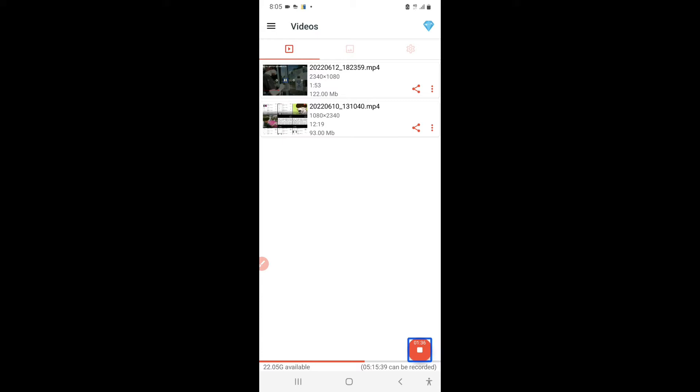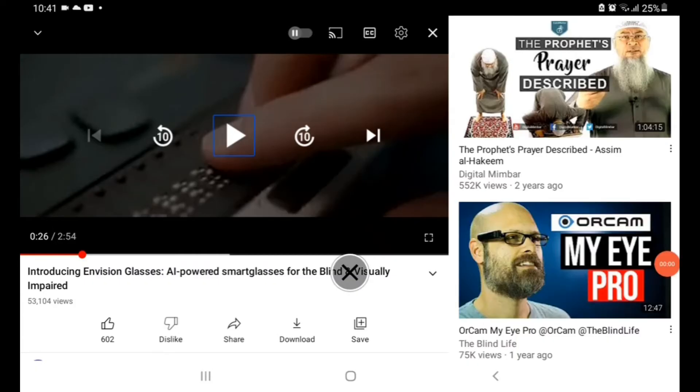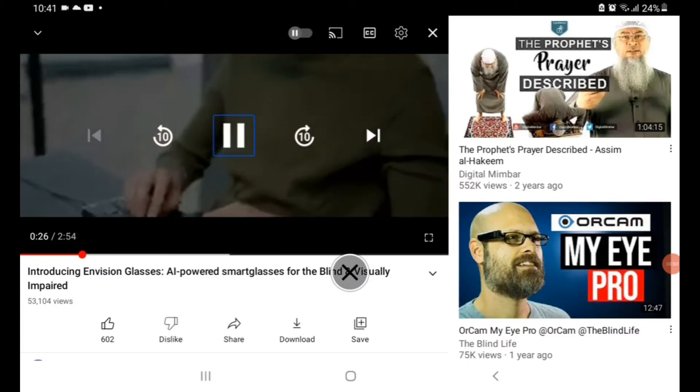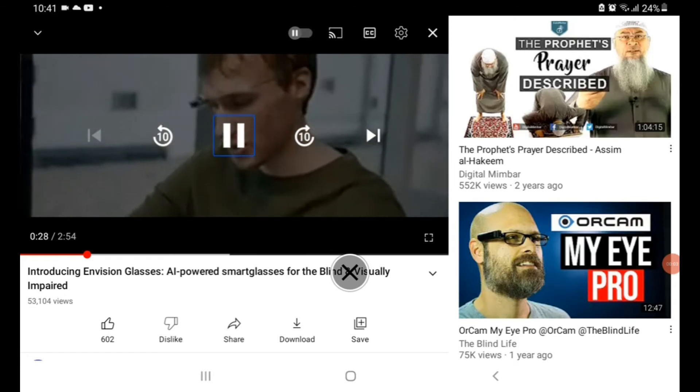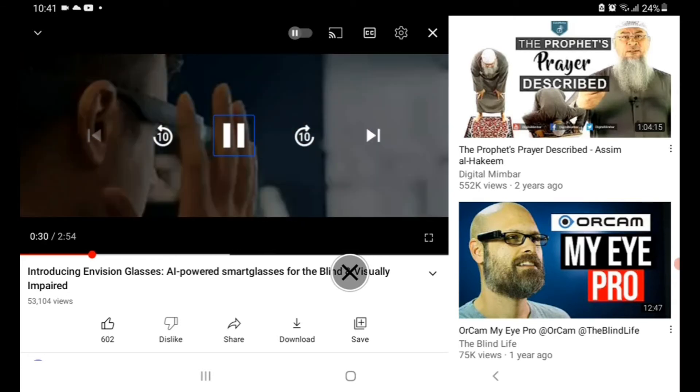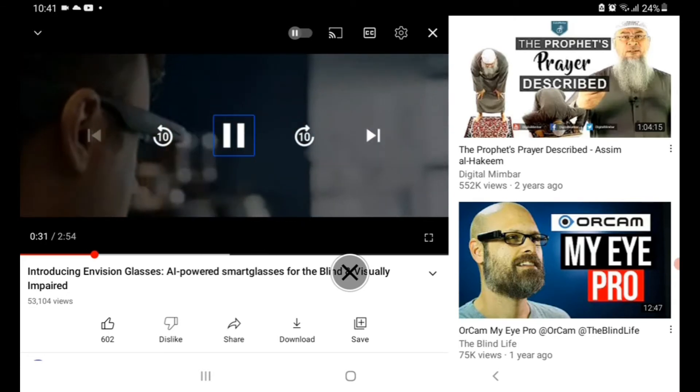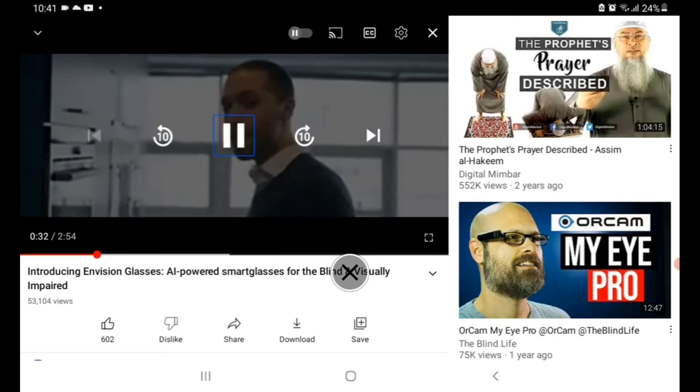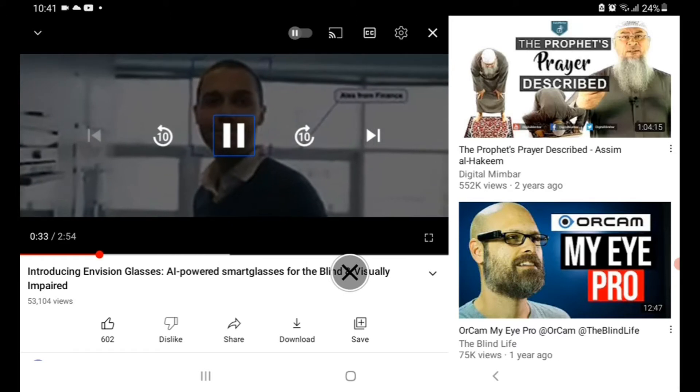In OrCam MyEye and Envision glasses, the first similarity can be that both of them can recognize faces. First we will look at Envision glasses recognizing faces and then we will look at OrCam MyEye recognizing faces. Pause video just before the deadline. It could be sharing a laugh with a colleague near the coffee machine. Looks like Alex from Finance.